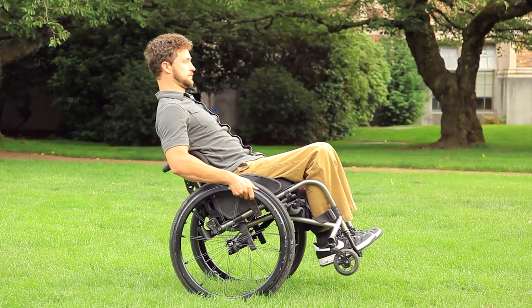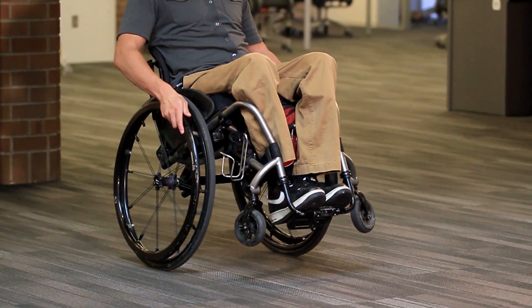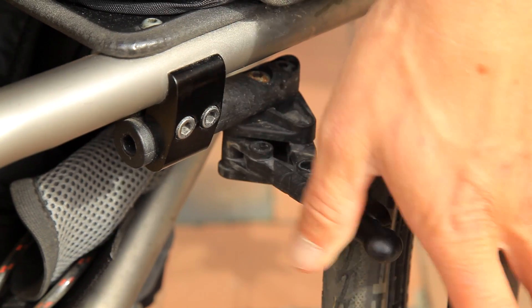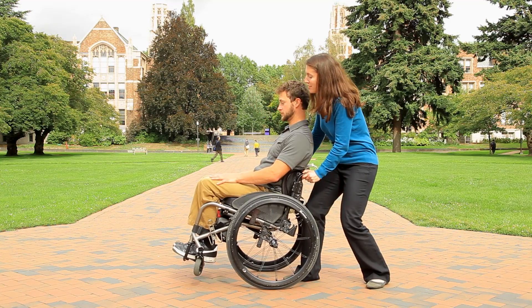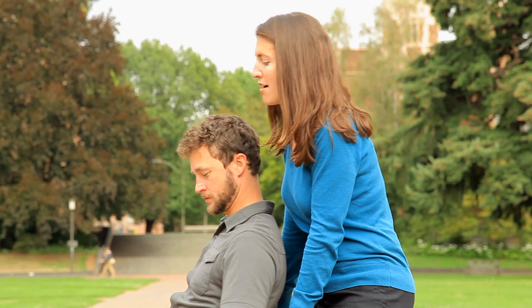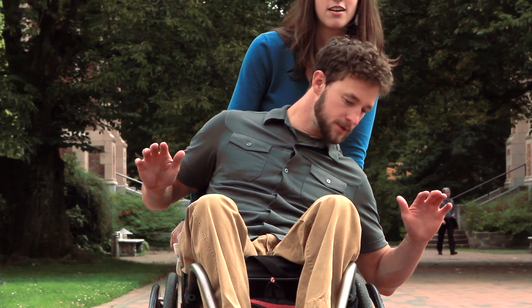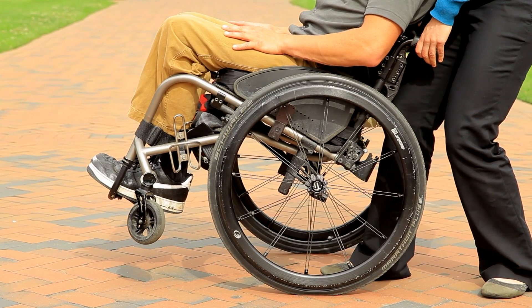Practice first on grass or thick carpet to give you a little more traction and help you feel more in control. To find your balance point, lock your brakes and have a spotter tilt you and your wheelchair back to the point where you feel balanced between tipping forward and tipping backward. This may be farther back than you expect. Notice how high your front wheels are off the ground.